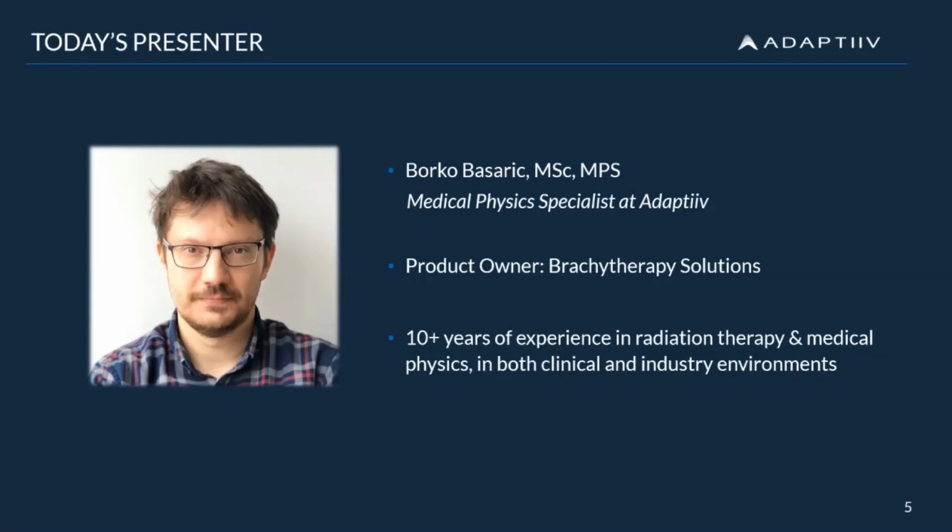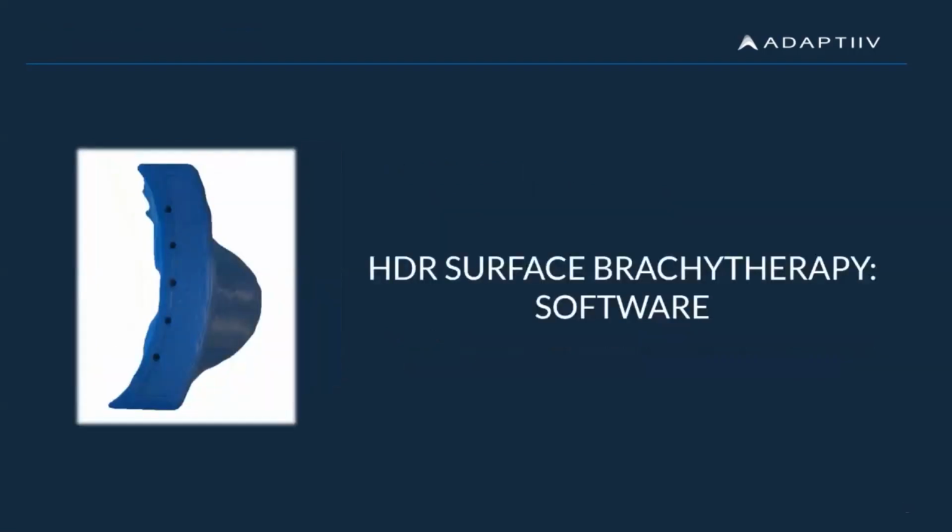He brings a wide range and great knowledge and background when it comes to not only brachytherapy, but also medical physics. So Borko will now take us all through our software and the new features and enhancements that have been made. I'll hand it over to you, Borko. Take it away.